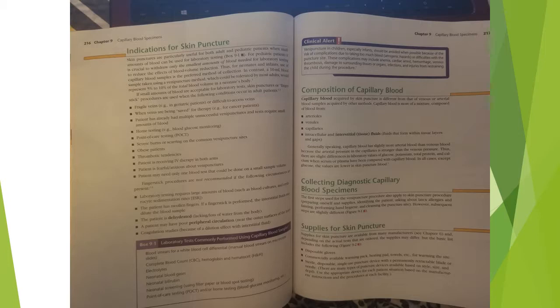Supplies for skin puncture. Supplies for skin puncture are available from many manufacturers. See Chapter 6. Depending on the actual tests that are ordered, the supplies may differ, but the basic list includes the following: disposable gloves, commercially available warming pack, heating pad, towels, etc. for warming the site, sterile disposable single-use puncture device with a permanently retractable blade or needle. There are many types of puncture devices available based on style, size, and depth. Use the appropriate device for each patient situation based on the manufacturer's instructions and the procedure at each facility.